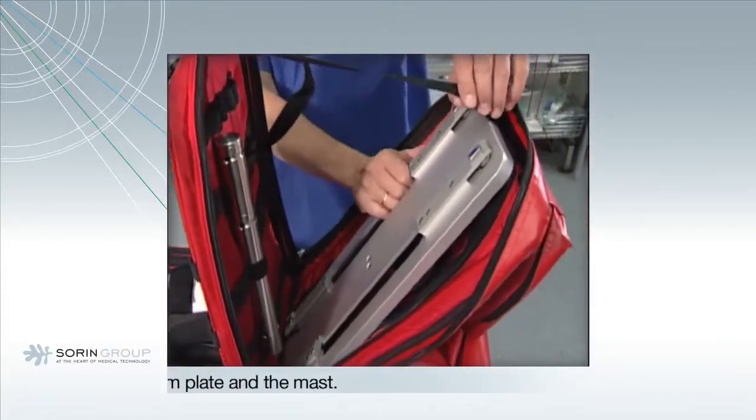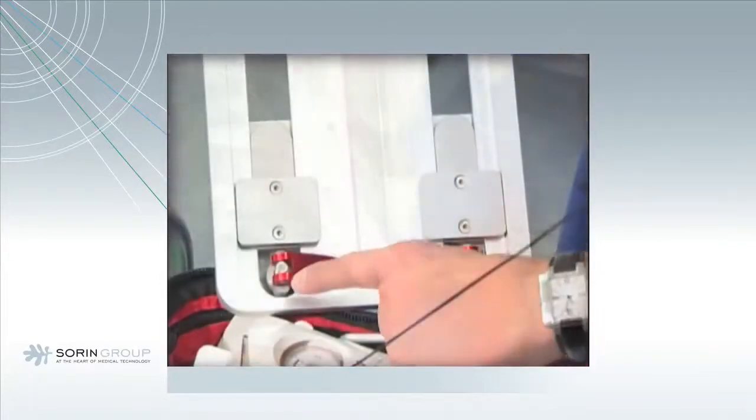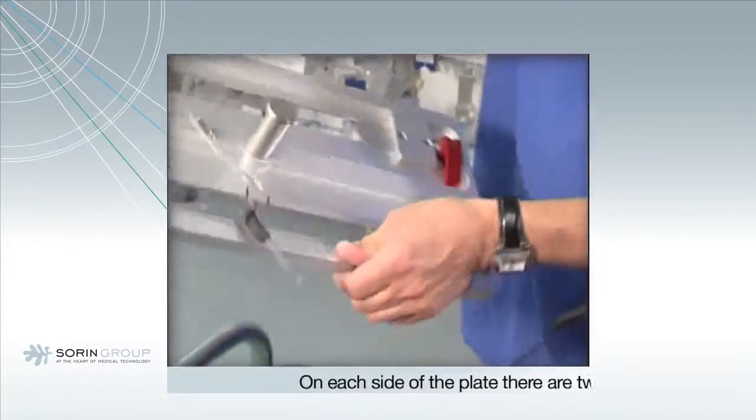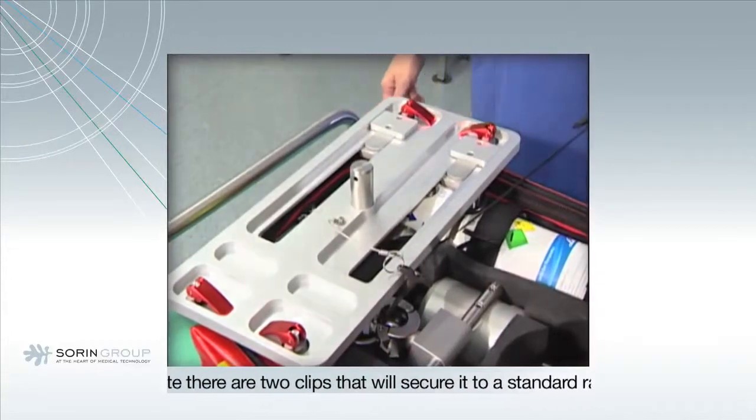Take the bottom plate from the backpack. There are two clips on each side of the plate which will secure it to a standard rail system in any vehicle for ground or air transportation. The plate can also be used to install LifeBox and LifeKit.